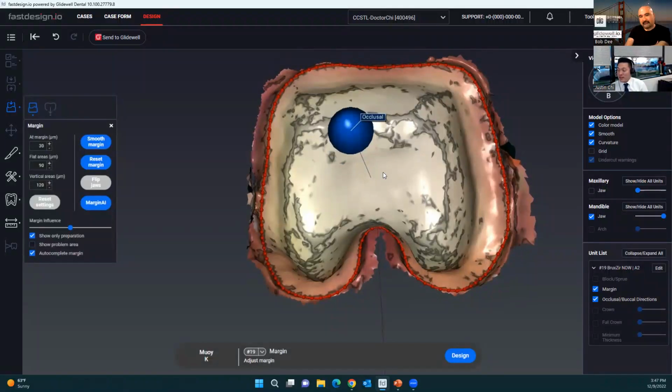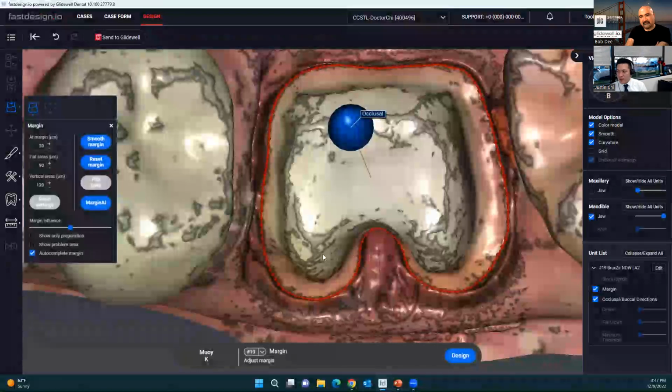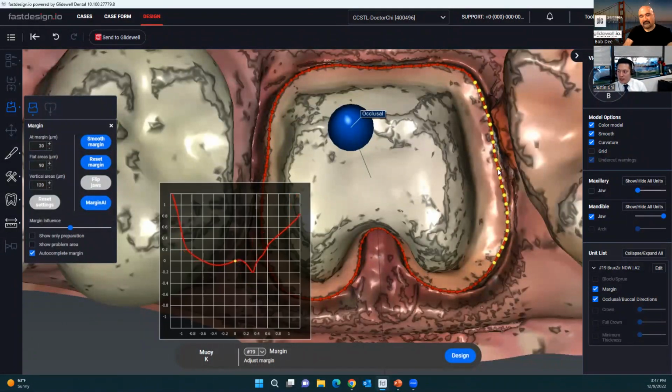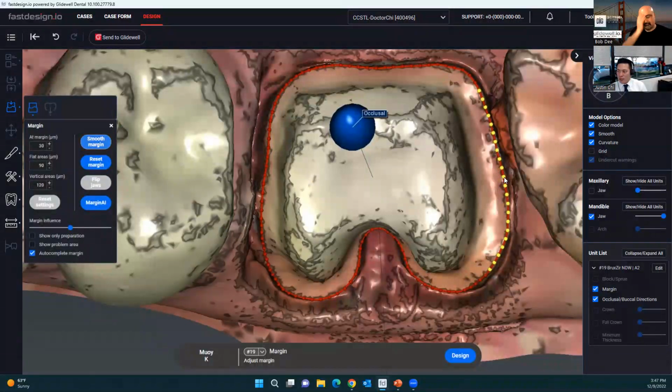We find usually 5 to 10. Many users get much more comfortable with this process. But hopefully I'm showing it fairly easily here. You can see it's really just a matter of the software pre-placing most of it for you, and you have these couple of functions to make edits, just clicking and dragging, or as you saw earlier, you can double click and draw a new line. Or like in the design process, if you make some accidental changes or changes that you wanted to reverse, you can undo very, very easily.